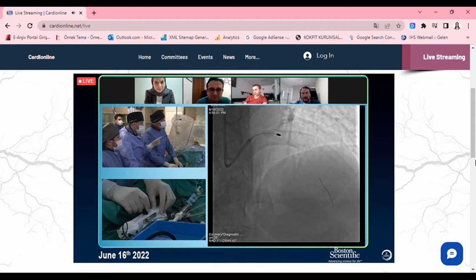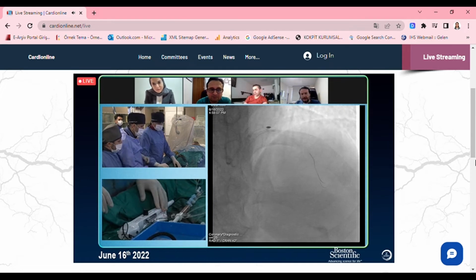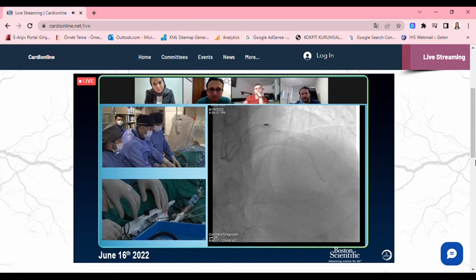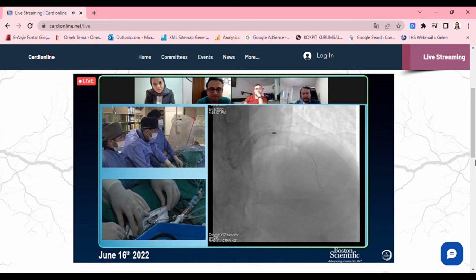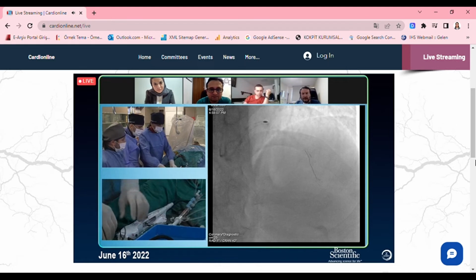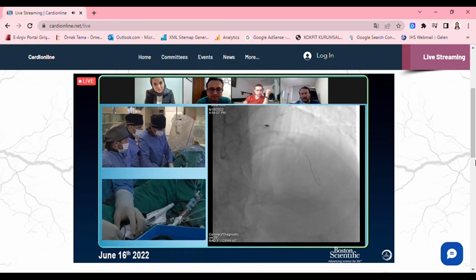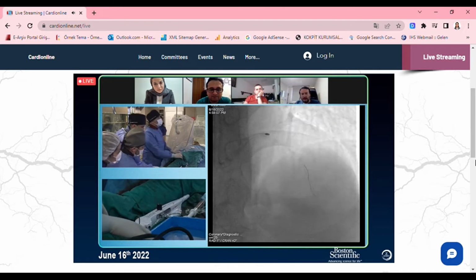Okay, stop. Now you are through. Hold the wire. Keep the wire. So I'll come a little bit back. We have to push slowly, a little push gently. No, I cannot. Drop the lock.